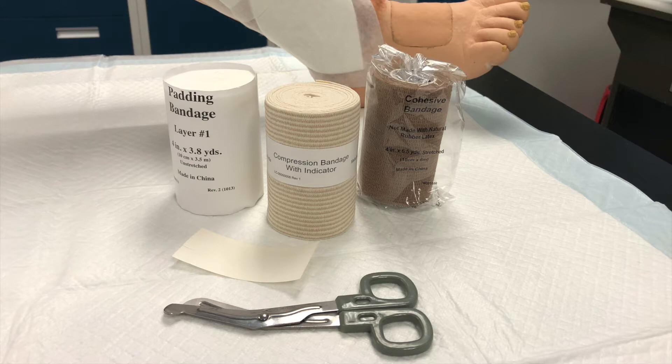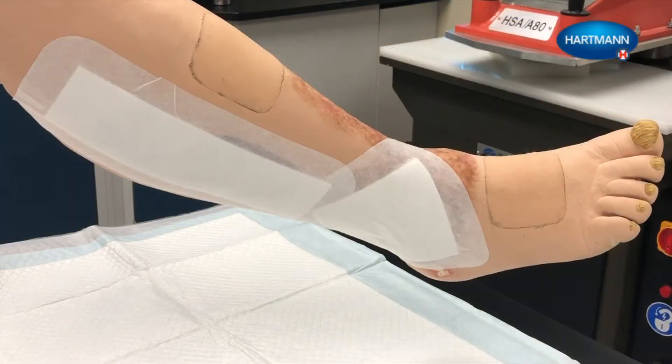Confirm the ankle circumference is greater than 18 cm. Ankle circumference may change as edema is reduced. Clean the wound and apply an appropriate dressing before applying 3Press. 3Press is not intended to be a primary dressing. When applying each bandage, make sure that the patient's foot is at a 90 degree angle to the lower leg.